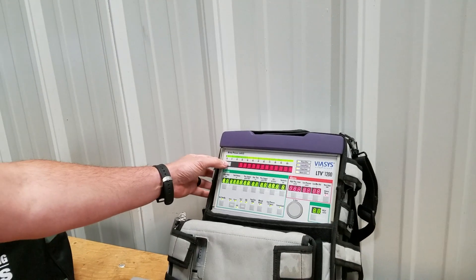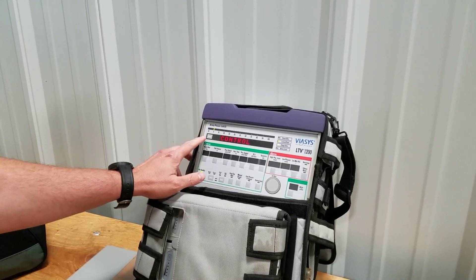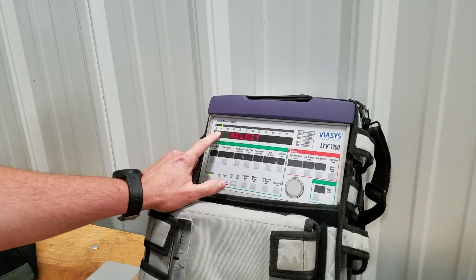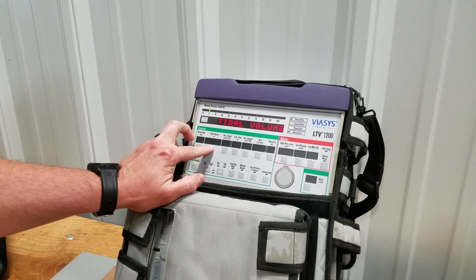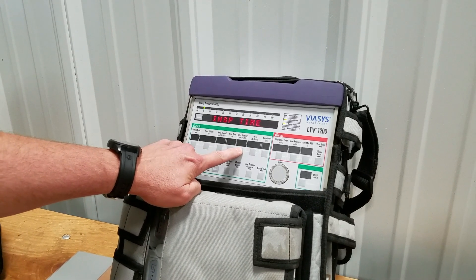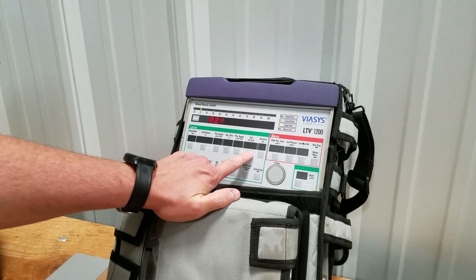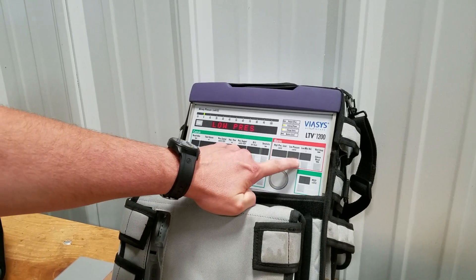When we confirm that, we press select again. Our next function is going to be 'control,' so we press select. If we press any other buttons it'll tell you what it is — tidal volume, pressure control, inspiration time, pressure support, FiO2, sensitivity, and so on all the way through.